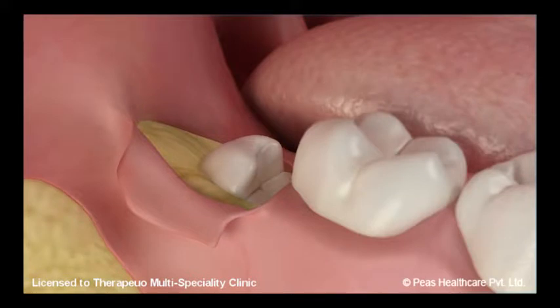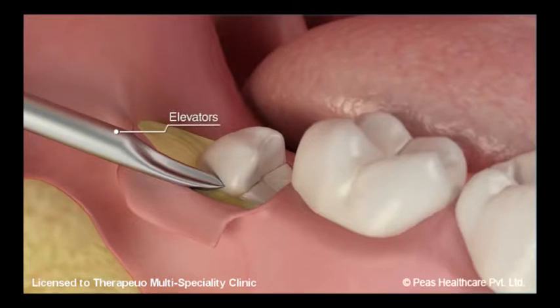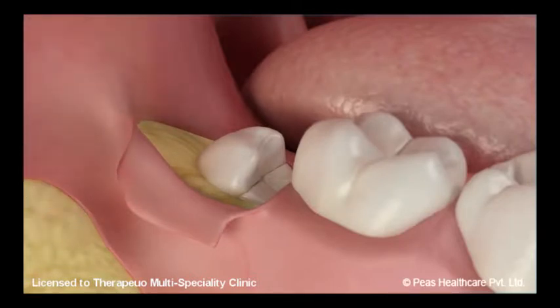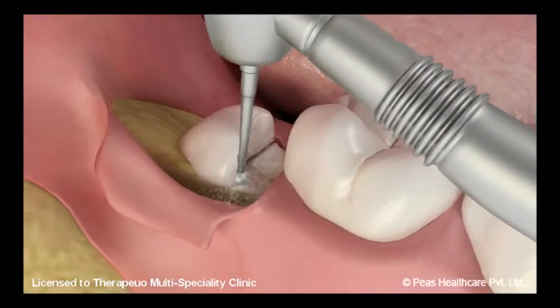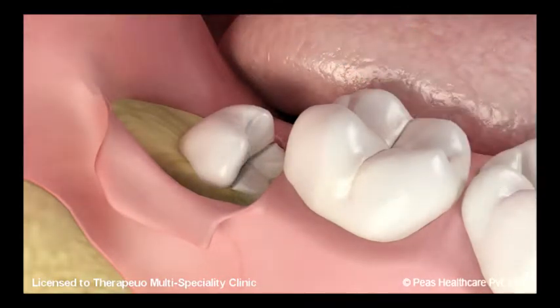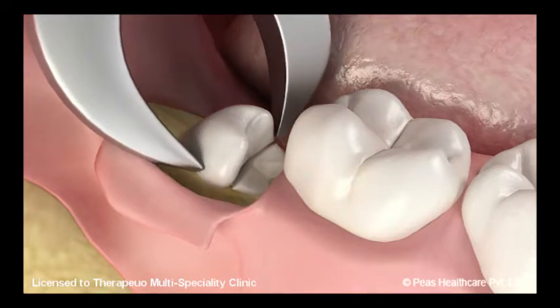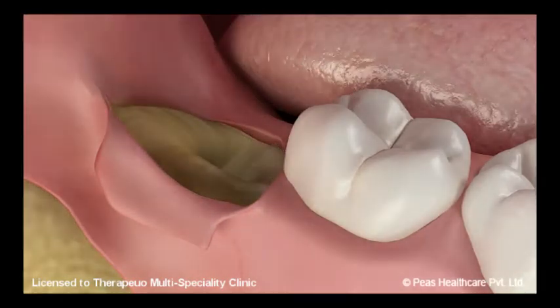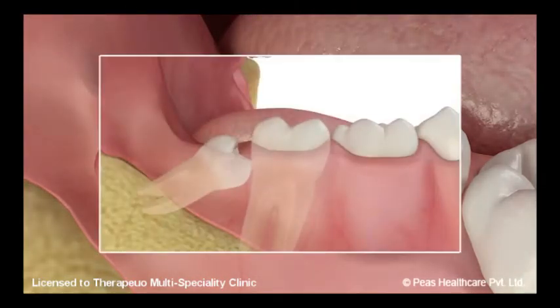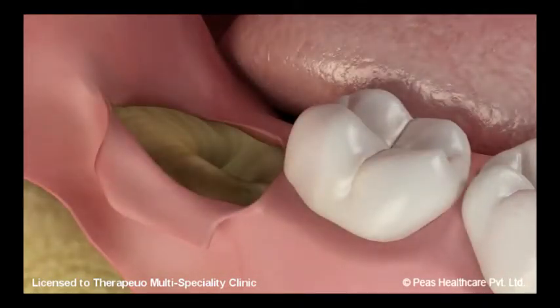The tooth is then either lifted up from the tooth socket using dental instruments called elevators or luxators, or it is cut into pieces with the help of a drill to facilitate easy removal. This decision is based on the angle of the tooth in the mouth and the extent of eruption of the tooth in the oral cavity.